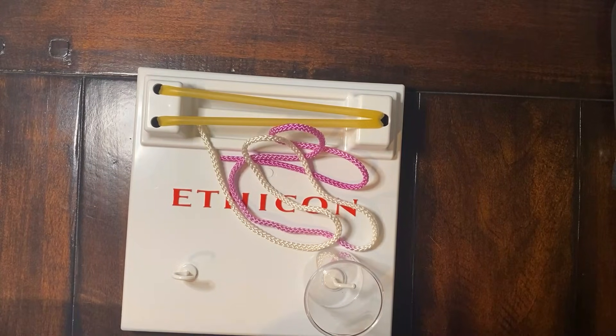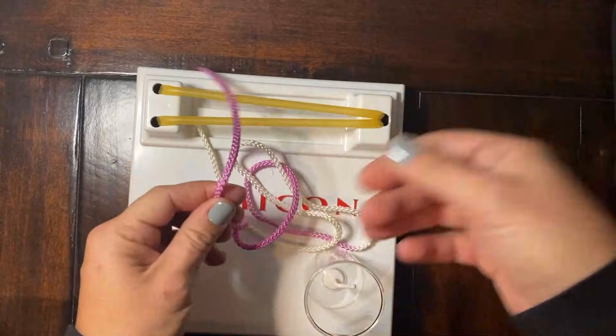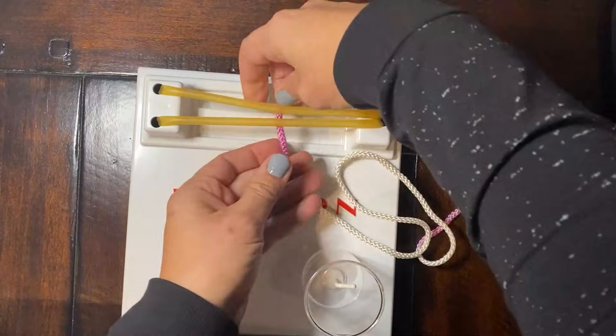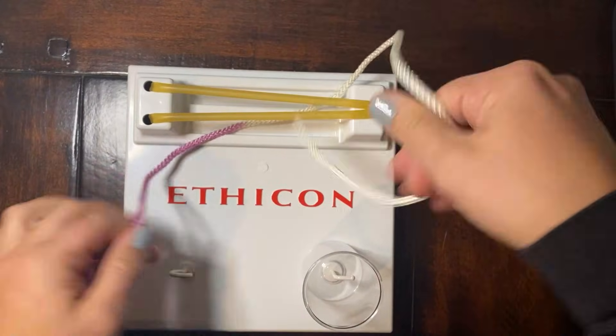All right, let's do our one-handed knot tying technique. We'll show you the right-handed way first. Our purple end will be our needle end. We'll throw that under, and our white end here will be our free end.